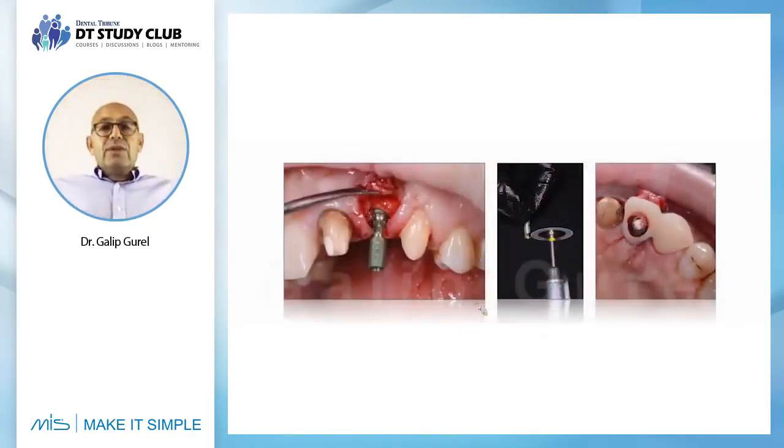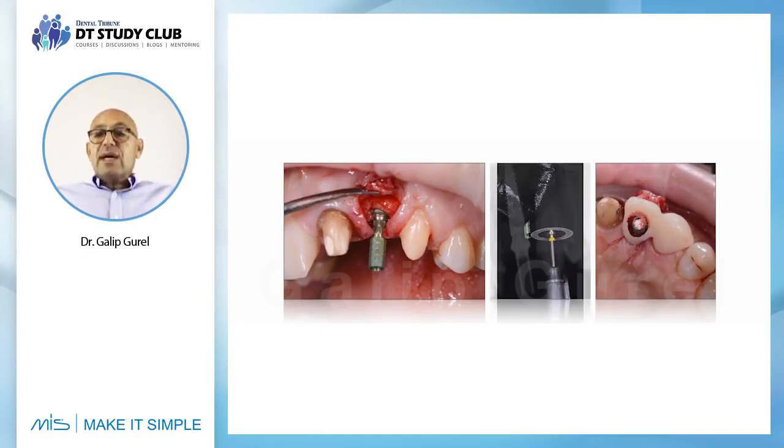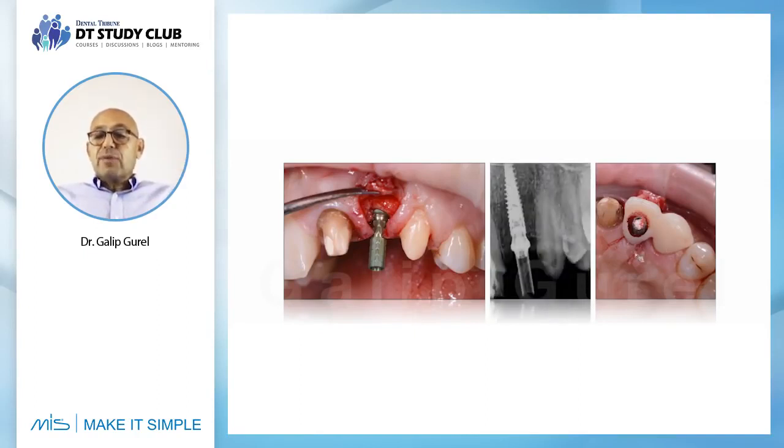So what we do is I just add the part that I would build my provisional on, got it into the right spot, got my provisional seated on that with a big hole inside, which is positioned over the canine, so it sits exactly in the stable position that it should.